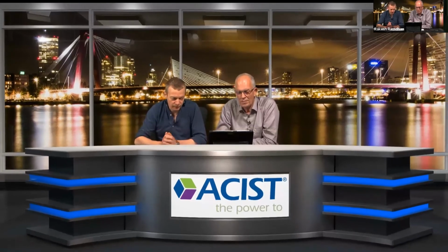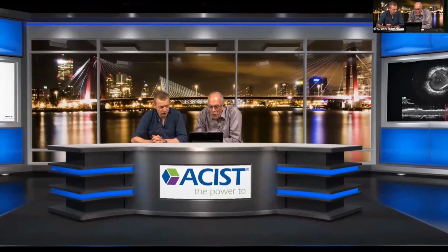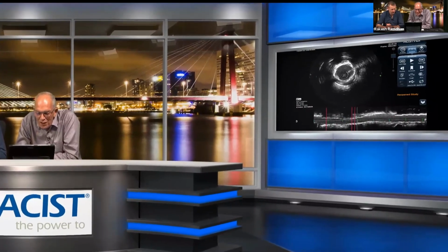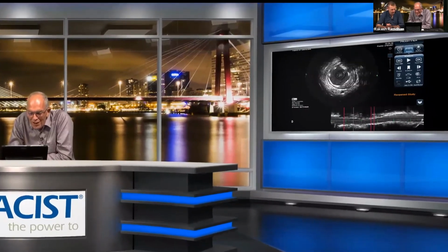So if you would have avoided this upfront, you would have achieved a better stent expansion. The edges, as you've seen, and maybe we can take another look at the edges, are also suboptimal. The stent was too short. Let's first look distally, because then we show the nicest thing. You see the stent here, ending in the middle of an eccentric plaque.